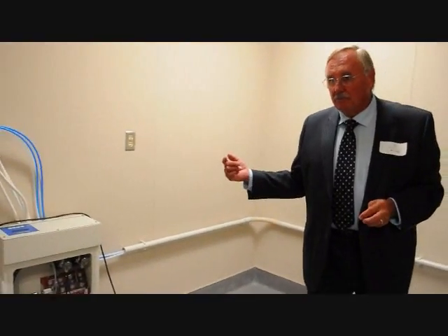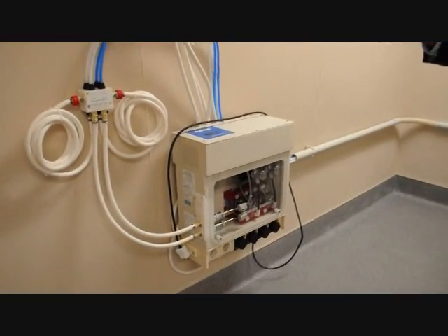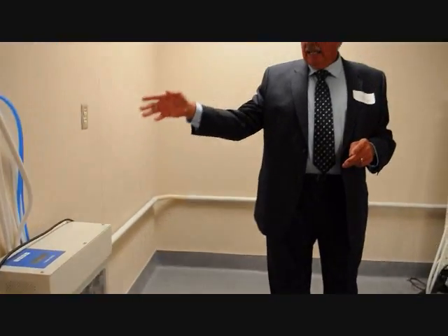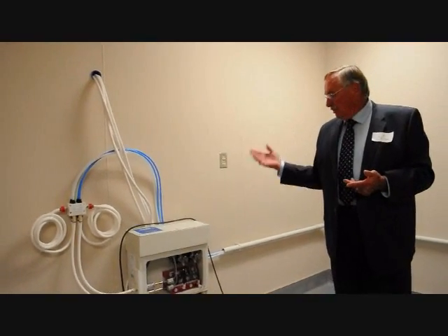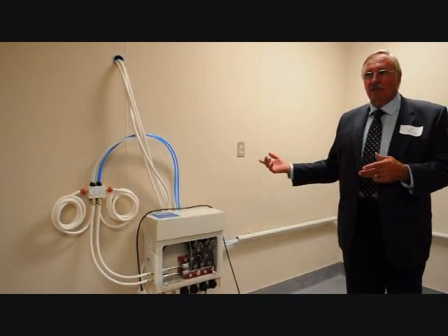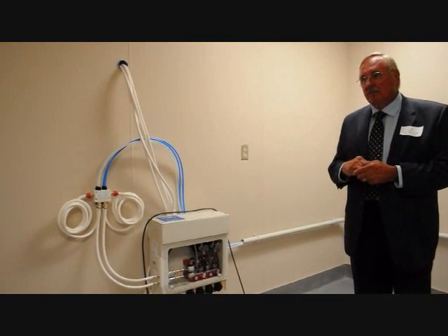The other machine we have in this room is for distribution of the acid. It's a machine that takes acid out of tanks that are stored in the next room, which is the acid storage room, and draws it into the machine, and then transports two different styles of acid that are pre-programmed for dialysis to each one of the bed heads and back. It doesn't require any kind of heat sanitization or anything, because being acid, it doesn't get any bacteria in it, so it doesn't require that. It just requires that it keep pumping all of the time, so we leave it running all of the time to supply acid.